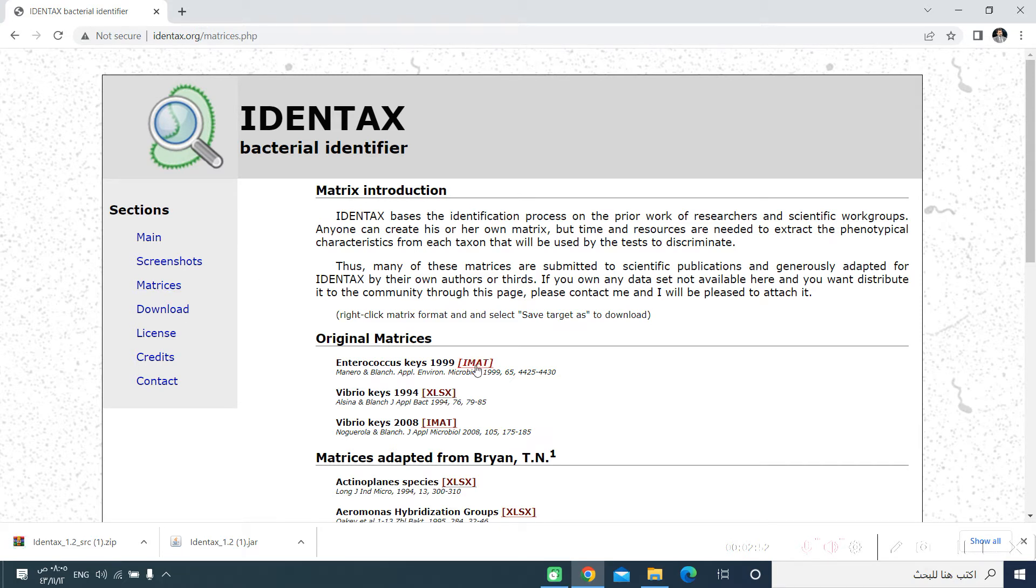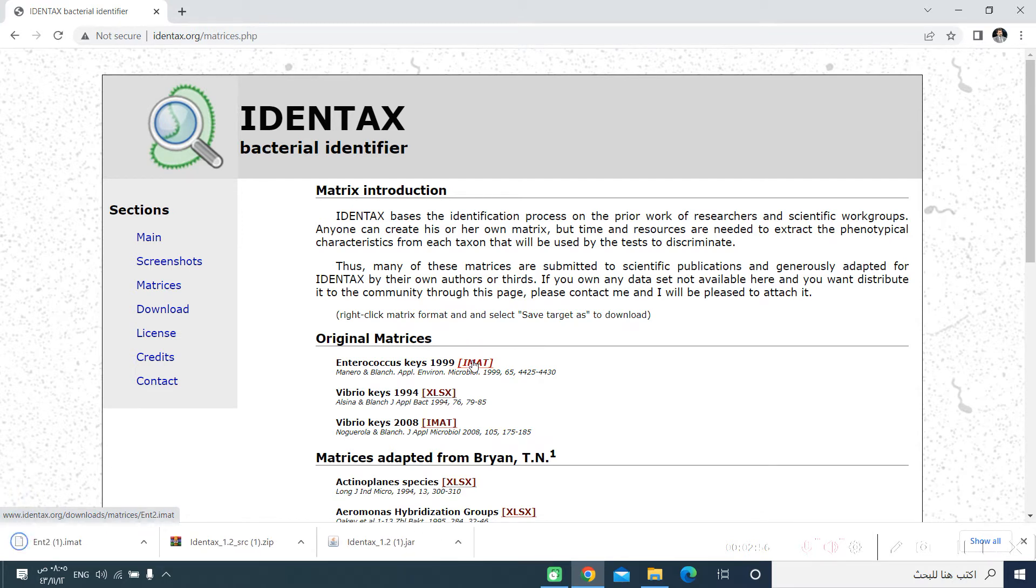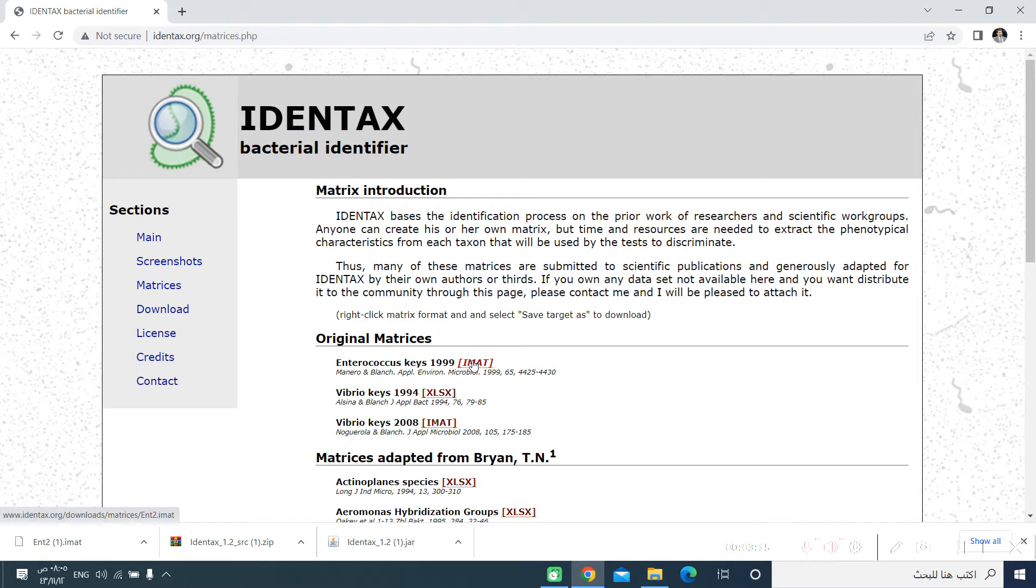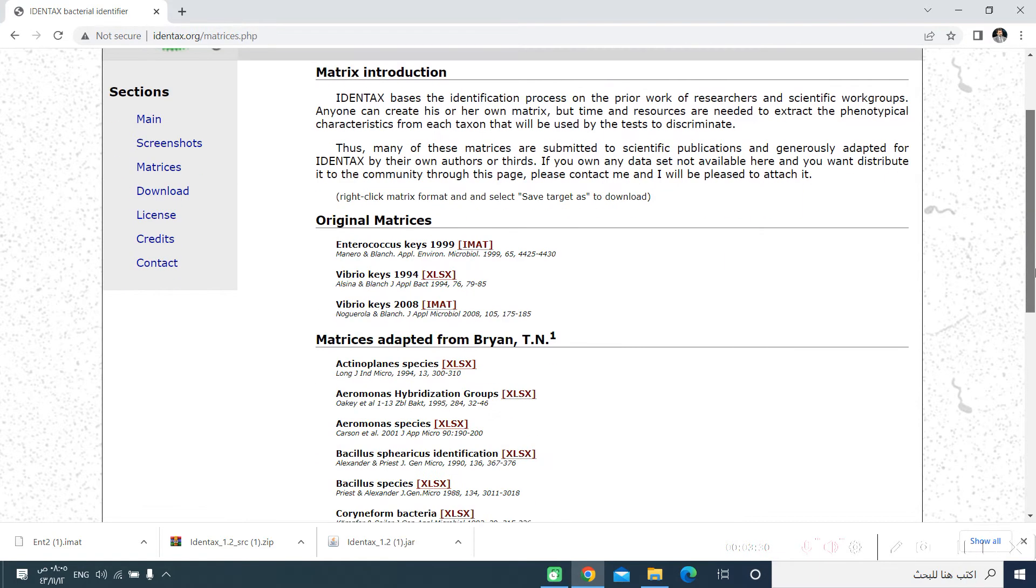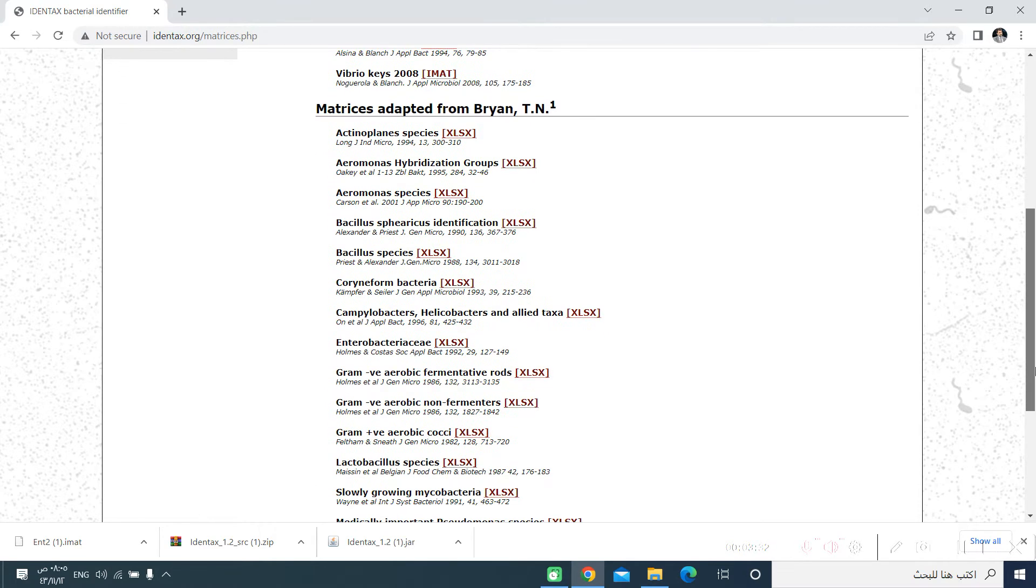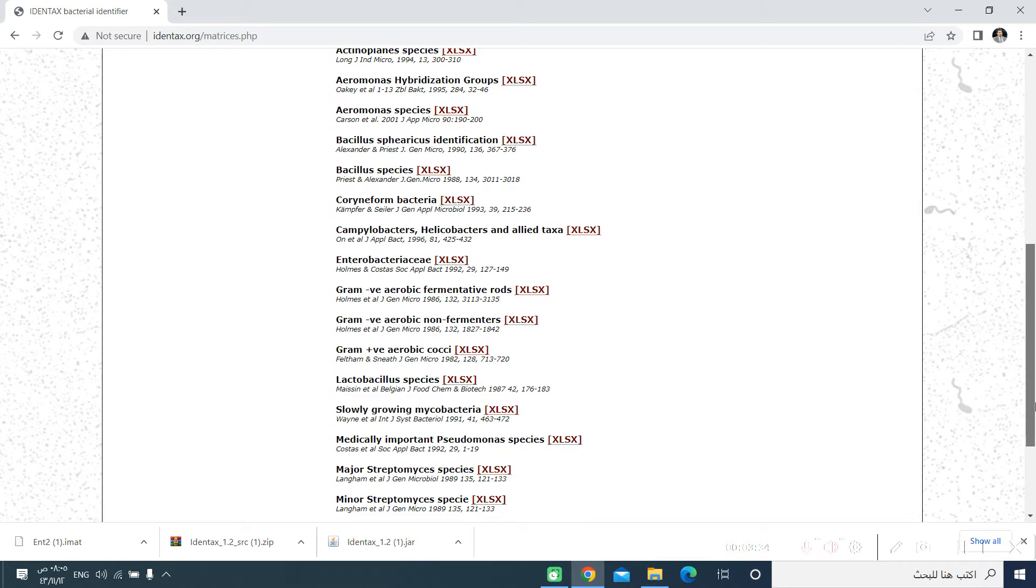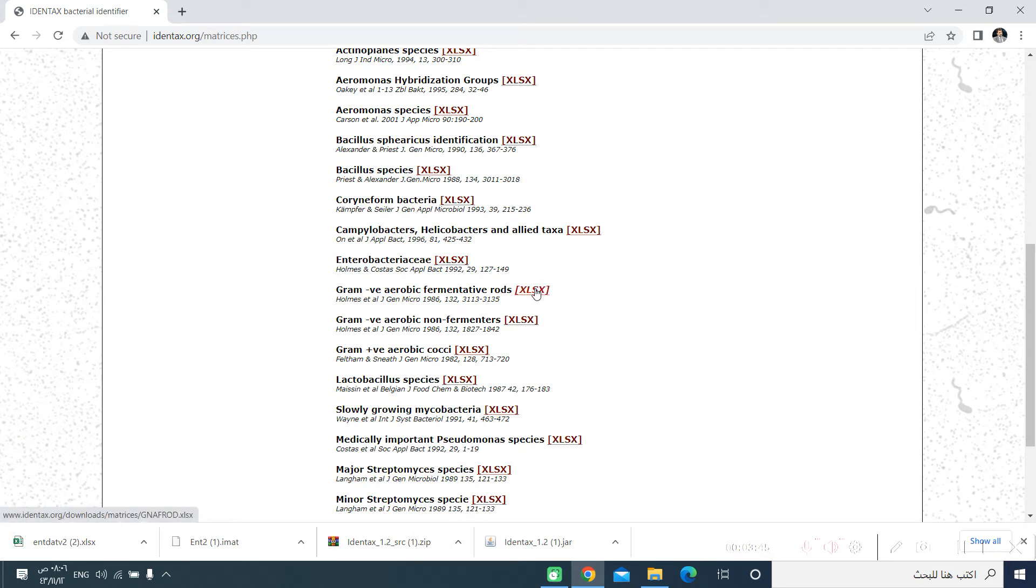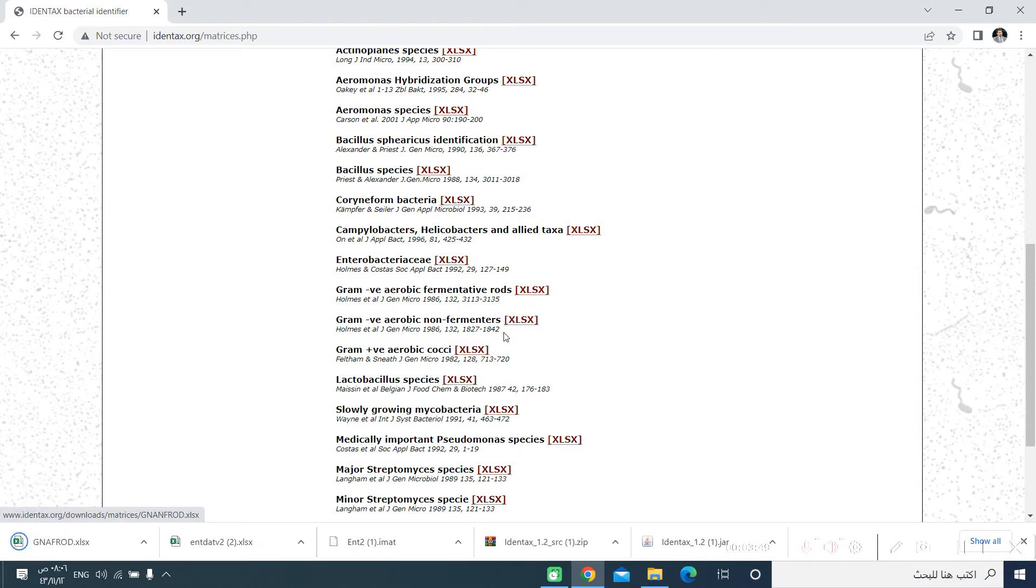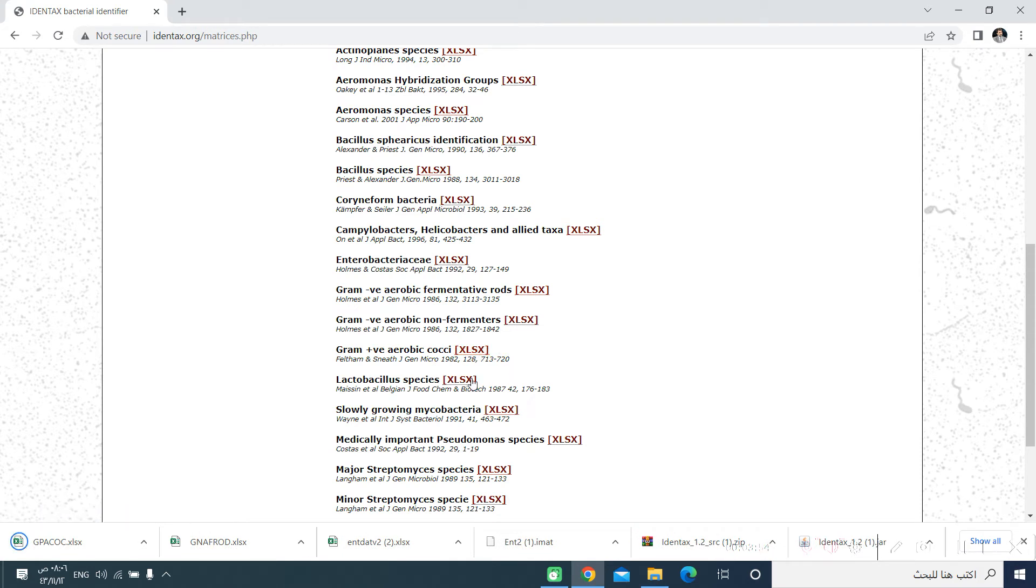So we have to download some of these matrices. Matrices are the microorganisms and the tests and the result of these tests for each of the microorganisms listed in that matrix. They are organized into different groups of microorganisms. Like you see here at the screen, the Enterococcus key, the Vibrio key. Vibrio key is available in two formats, the Excel format and the IMAT format. We can download the most commonly used matrix, which is the Enterobacteriaceae matrix. We also can download the Gram-negative aerobic fermentative rods, the Gram-positive aerobic cocci, and the Lactobacillus species.